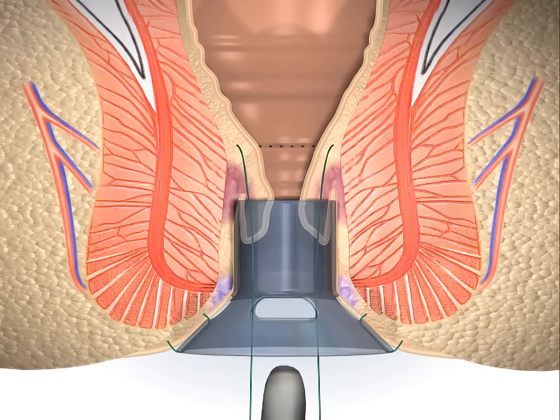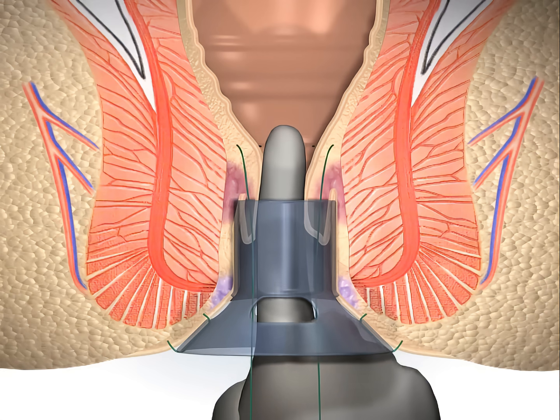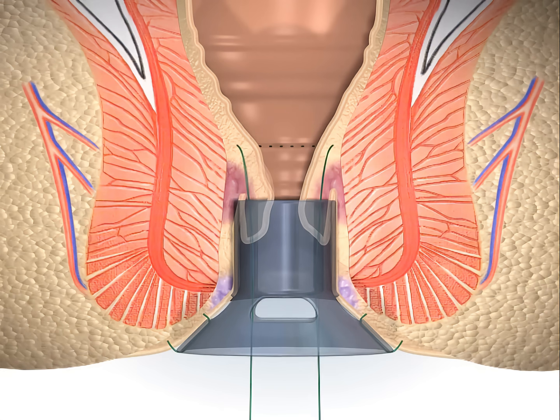A finger is placed in the anus and the purse-string is tightened to check that there is uniform circumferential closure and no skips or gaps. The location of the purse-string suture must ultimately result in a staple line that resides at least 2 centimeters above the dentate line.